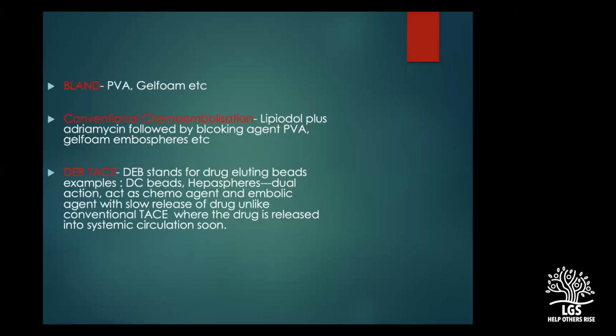And when it comes to TACE, there are different types of embolizations that we do. At Rela Institute, we follow conventional chemoembolization. Drug-eluting bead TACE is usually used for a certain subset of patients, but conventional chemoembolization, which involves Lipiodol plus a blocking agent, has given us fantastic results. Conventional chemoembolization is almost equally as good, so I stick to conventional chemo for most of my patients, except for very few, where there is a concern that they might have a lot of systemic side effects. That's when we resort to the DEB-TACE.